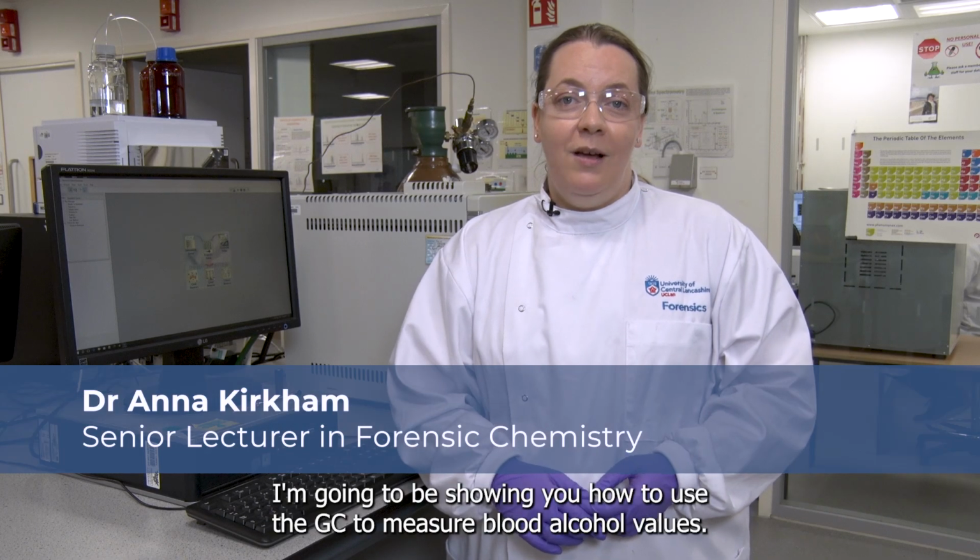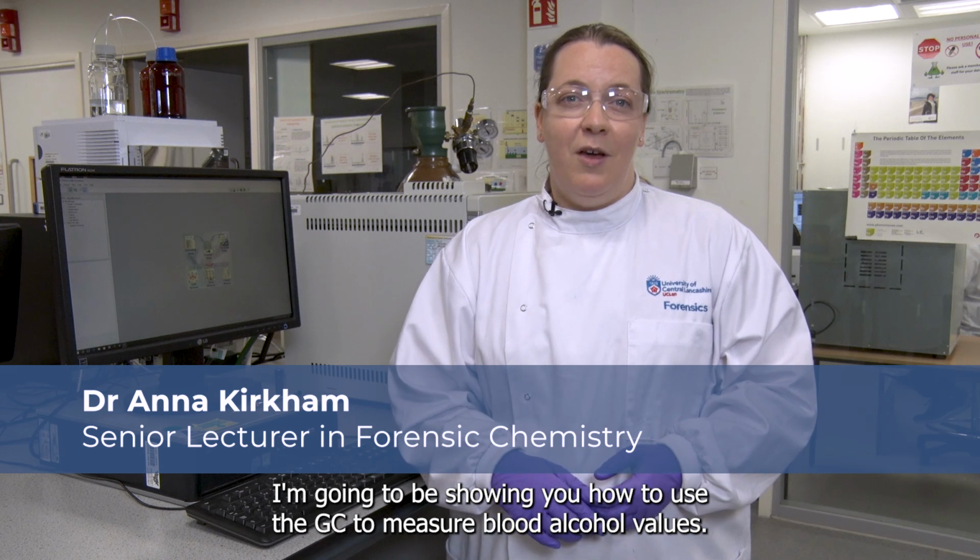Welcome to this tutorial. I'm going to be showing you how to use the GC to measure blood alcohol values.